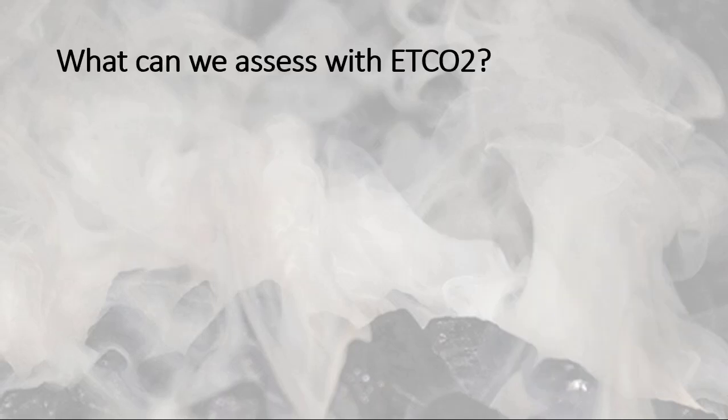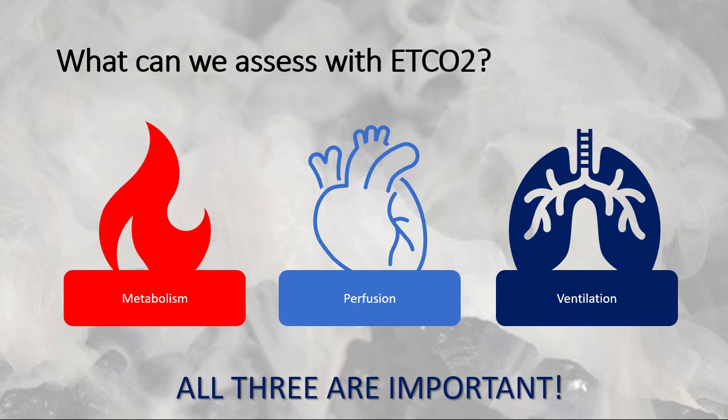So with that in mind, what can we assess with end-tidal CO2, both directly and indirectly? Well, I've already given you all the answers to this. We measure metabolism, we measure the perfusion in the capillary bed, and we measure ventilation. And all three of these are important. So if you thought end-tidal CO2 is just focusing on tube placement, you've missed a huge part of its usefulness.